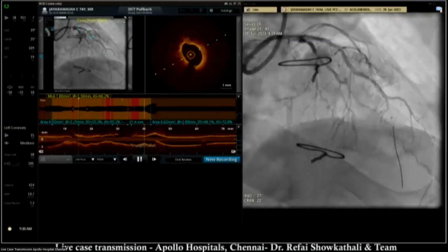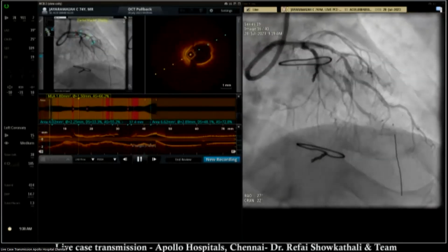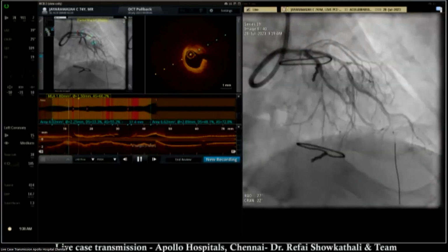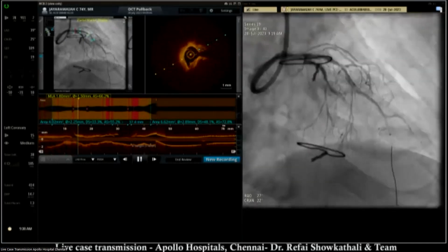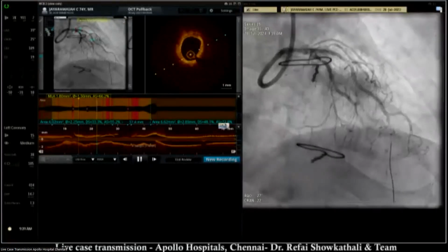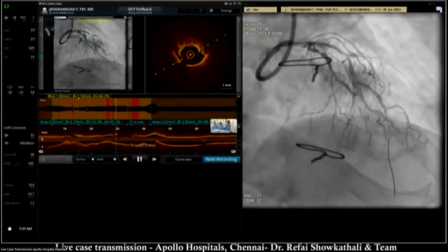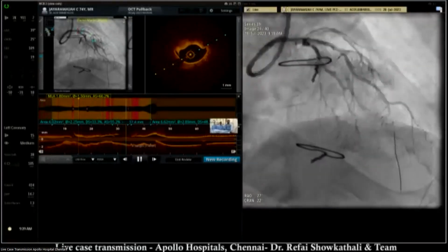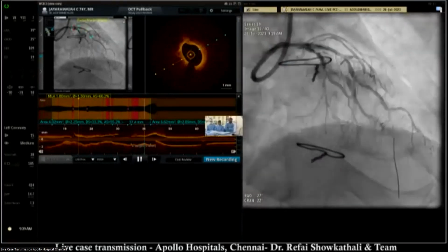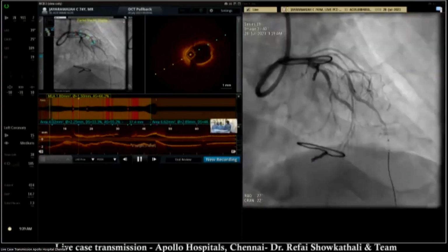Dr. Parikh, I wanted to ask you specifically a question. Antonio Colombo has been showing live cases of a drug-eluting balloon alone strategy for such LADs even. What is your thought on that? Yeah, we have been using drug balloons, but not in these cases, mainly in mid to distal LADs, 2 millimeter diffuse diabetic disease side branches. So though Colombo has been promoting it, I think we don't have data to make it a practice. Right.